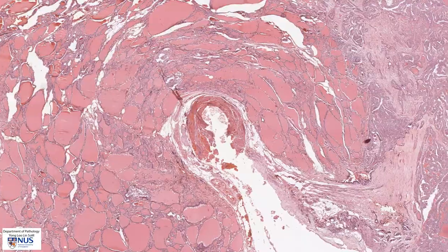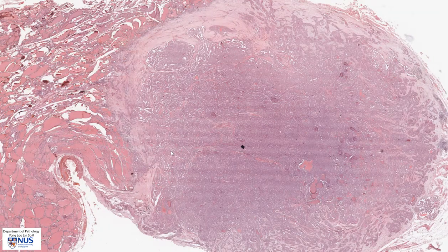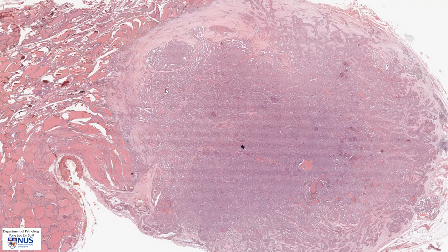Let's move on to the tumor. We can see that this tumor is not encapsulated. There is a fibrous area here, but there is tumor present both within the main tumor mass as well as right at the outer edge of this fibrotic area. And at low magnification, there appears to be these papillary-like structures.